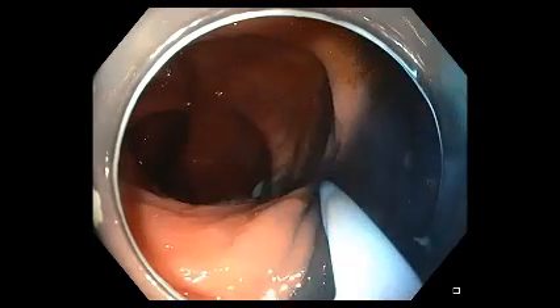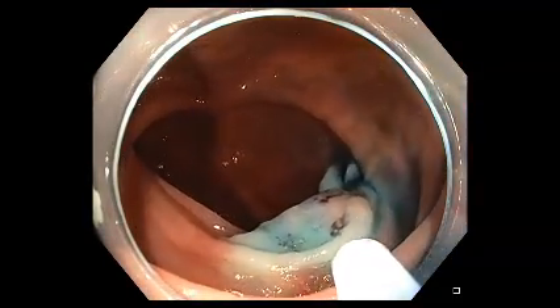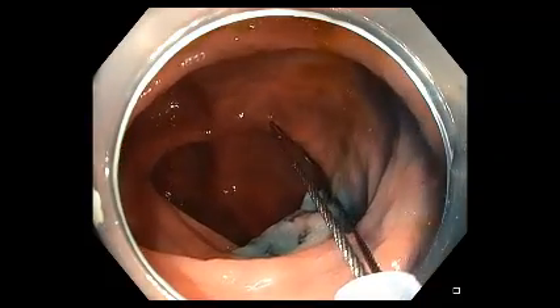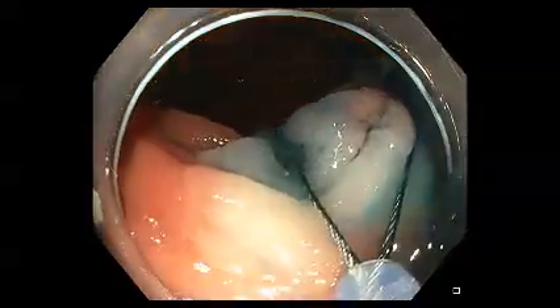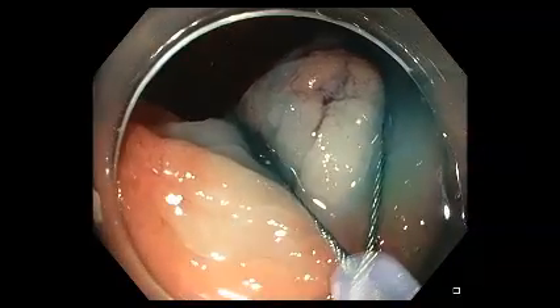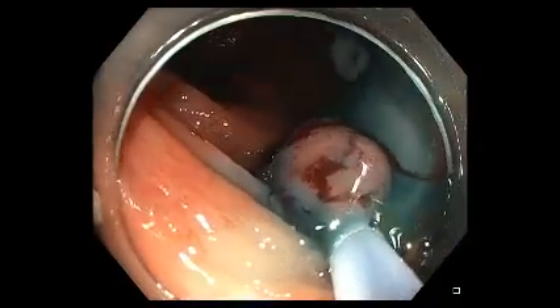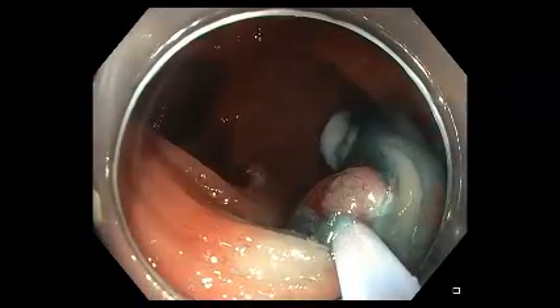The snare resection usually requires a stiffer snare, usually a spiral snare or one with very sufficient metal stiffness in the metal gauge to obtain a good margin. We typically place the snare over the lesion and push down into the wall while suctioning the air out of the colon to allow the tissue to lift up into the snare lumen.